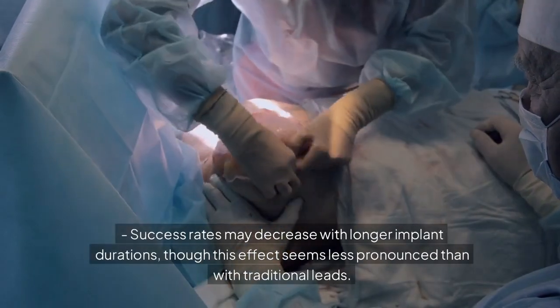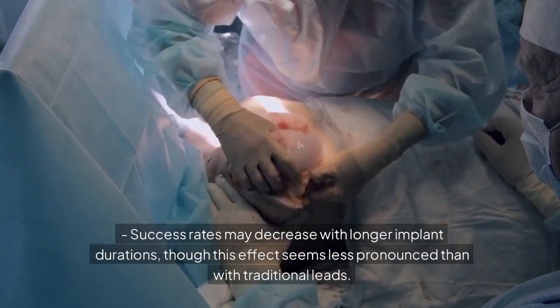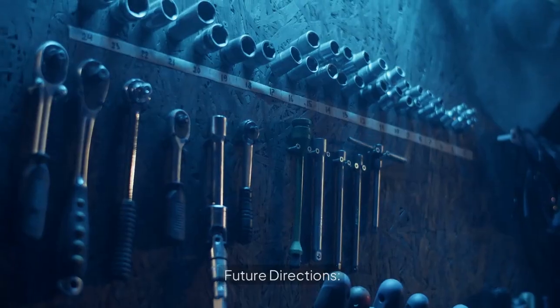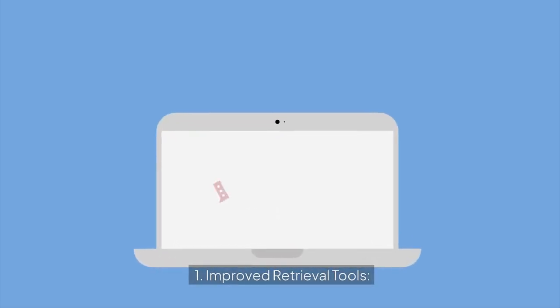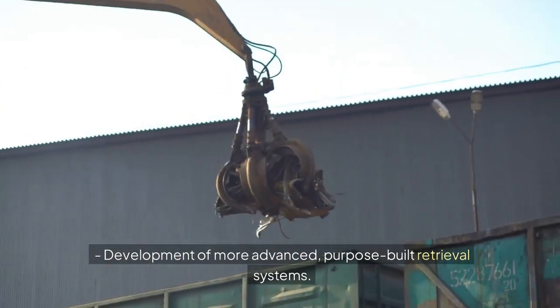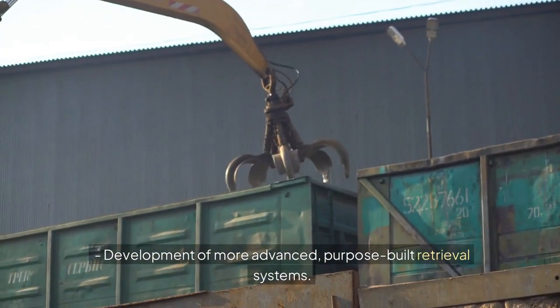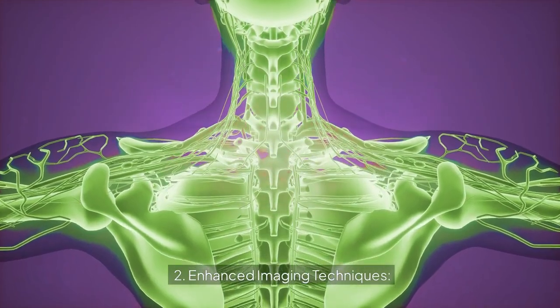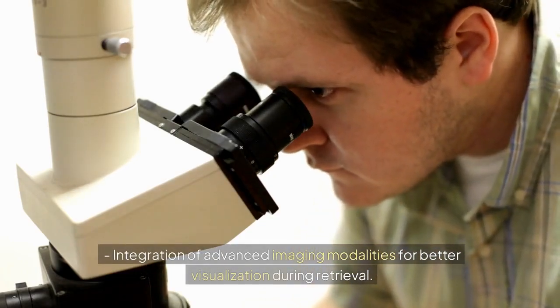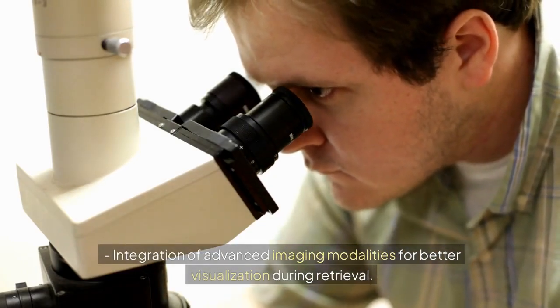Success rates may decrease with longer implant durations, though this effect seems less pronounced than with traditional leads. Future directions. 1. Improved retrieval tools. Development of more advanced, purpose-built retrieval systems. 2. Enhanced imaging techniques. Integration of advanced imaging modalities for better visualization during retrieval.